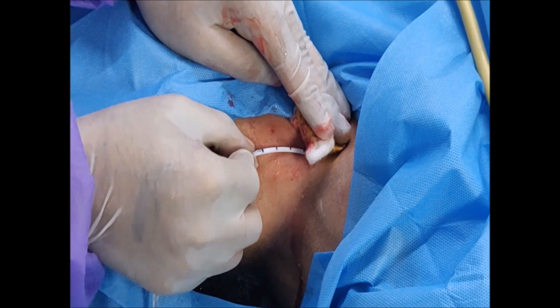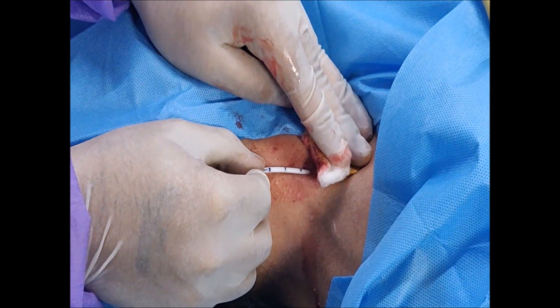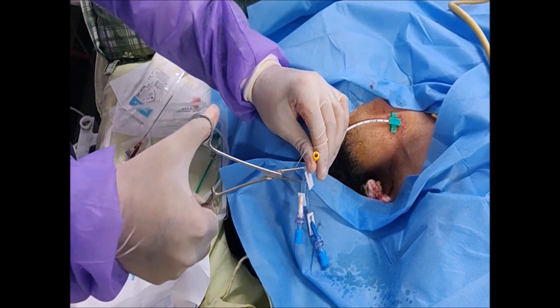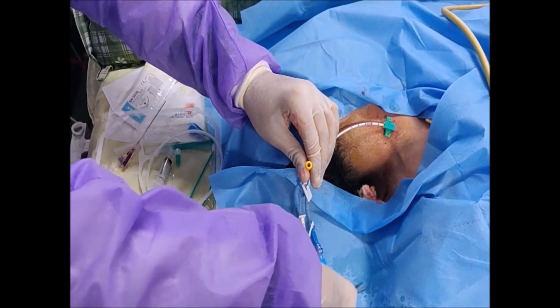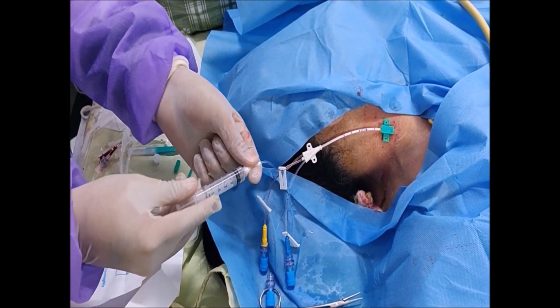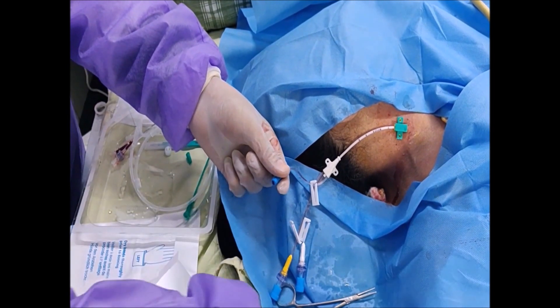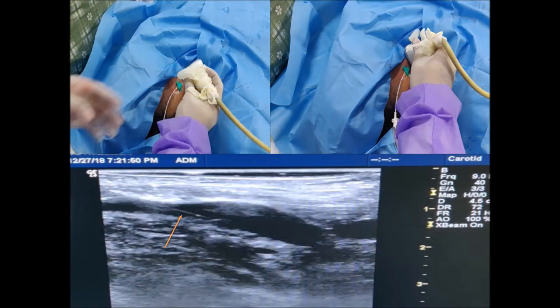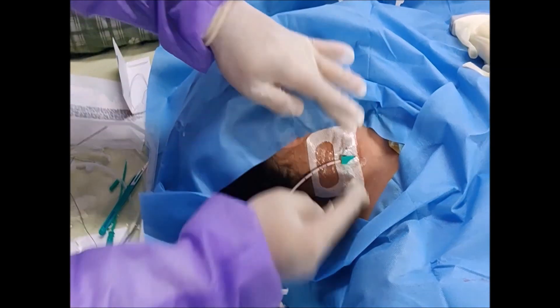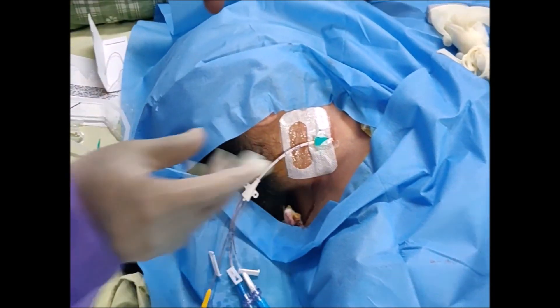Insert the catheter to a depth that places the catheter tip at the junction of the superior vena cava. Steady the catheter and use forceps to remove the guide wire, then check for blood return. Confirm that all ports of the catheter are working and flush them with heparinized saline. Cap all the ports at completion. Confirm the position of the catheter using the linear probe, preferably along the long axis. Carefully secure the line by suturing it to the underlying skin and apply sterile dressing over the line.